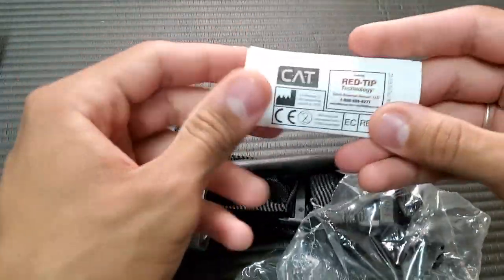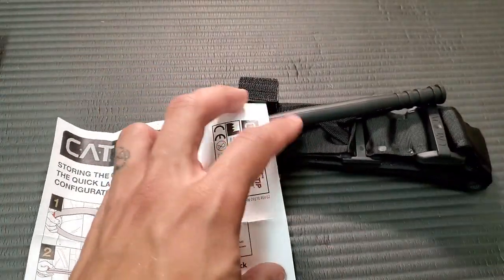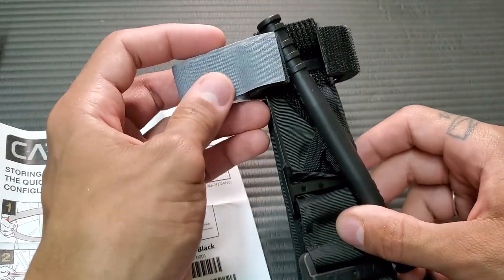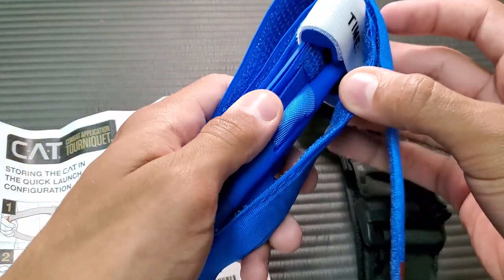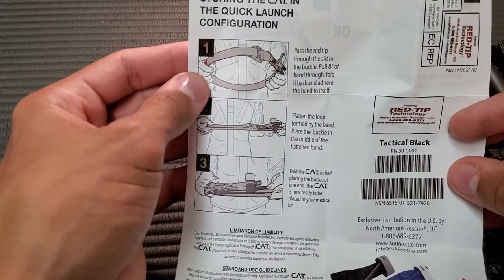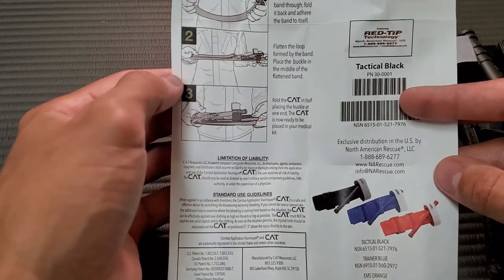So on the CAT, you can see they have the red tip, which is a little bit easier to identify where the end of the tourniquet is. I do like how they teach you how to store it. Looking at the CAT tourniquet, it's configured a certain way — the Velcro tab isn't pulled across, and the windlass is inside the buckle parts. On the cheap tourniquet, that's not the case, and I'll go over why that's important.